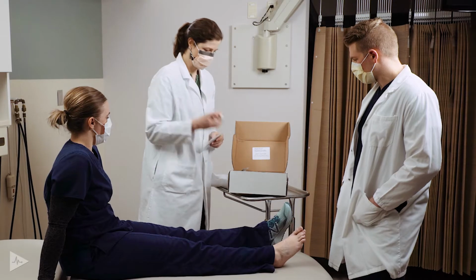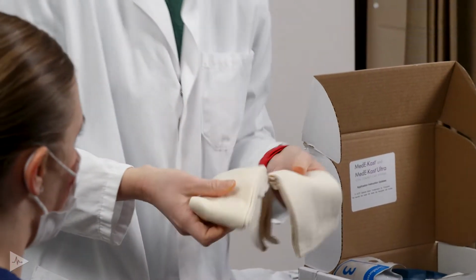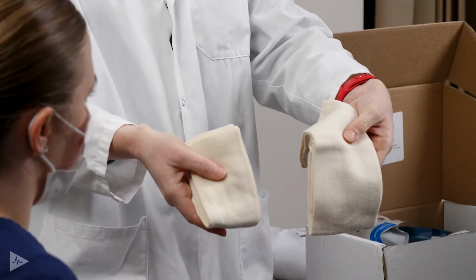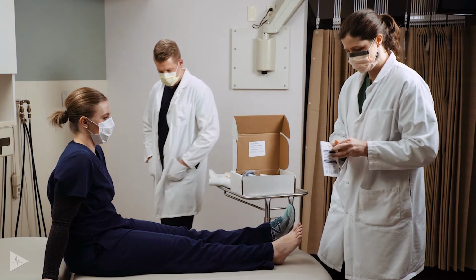So to start out in this cast kit, you will want to find your medical grade foam. You can use this as the primary dressing or in addition to other dressings on the wound bed. You do want to keep the dressing thin. You'll then look for paper tape to start out with. You'll have a bandage, scissors, and then we have 2 different sized protective stockings, depending on the girth of your patient's leg. So the medical grade foam will be applied first.